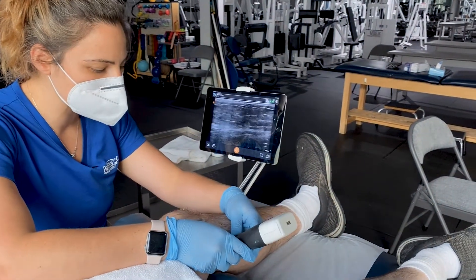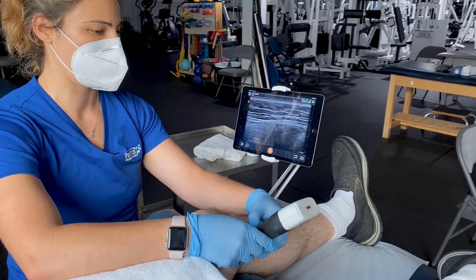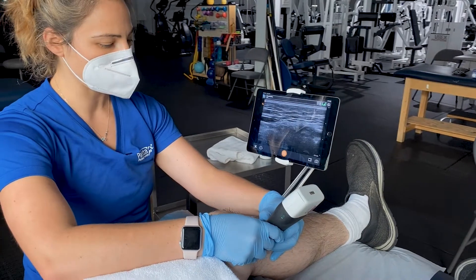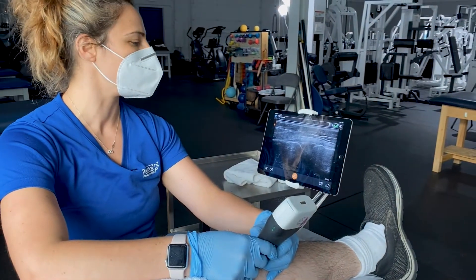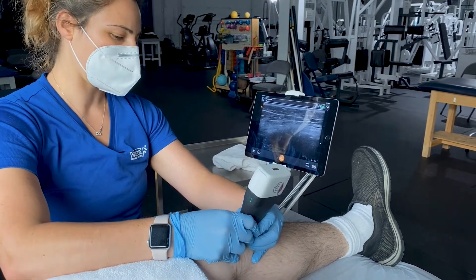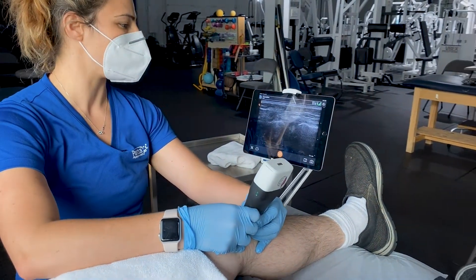Now I'm going to take some shots of the inner knee area. This is a spot where a lot of patients come in complaining of tenderness and pain. We're going to be looking at some of the structures in here. One of the main structures that can have injury is the meniscus, and we're going to see a portion of that and how that's doing.